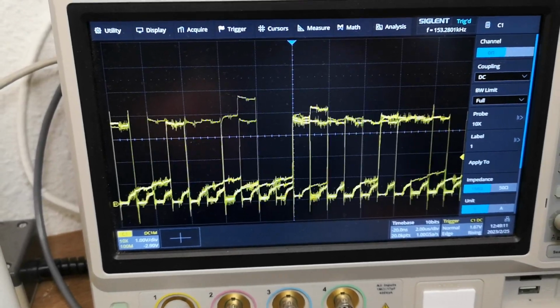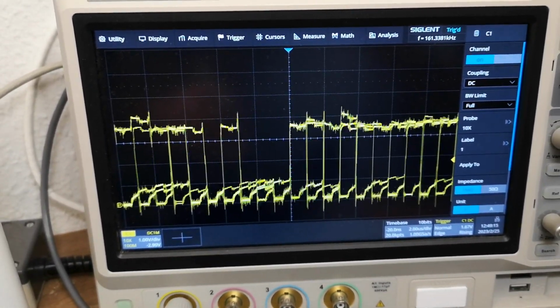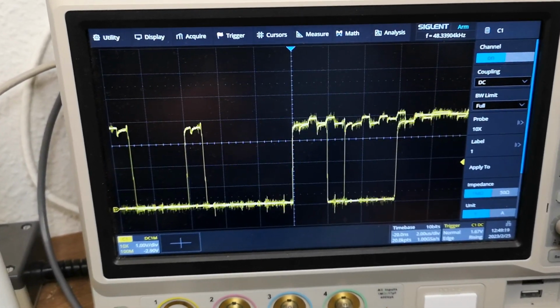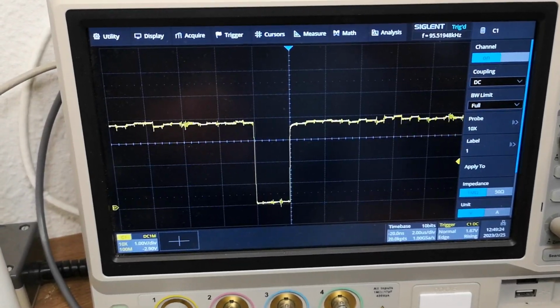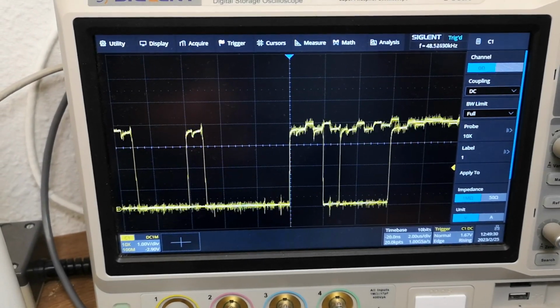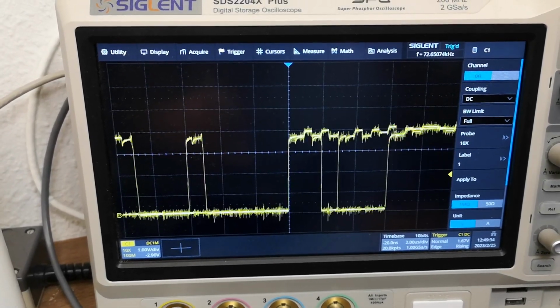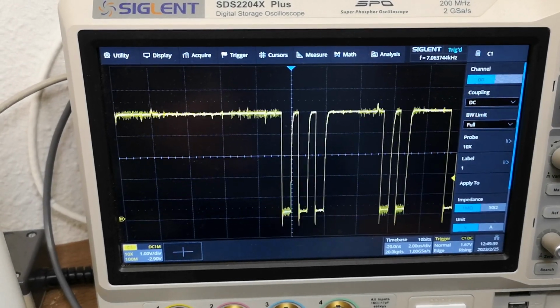That's the different data lines. Depending on where it's coming from, it looks like that. And if I go and look at the address lines again, look at that. Some funny stuff, huh? See, this is more like it. This is how it should be. But this is not so nice. But of course it is within limits and all that kind of stuff. But, well, see, much higher address line right next to it.